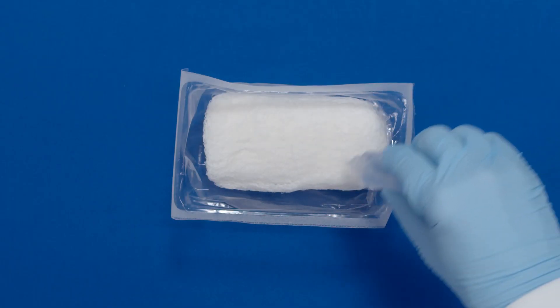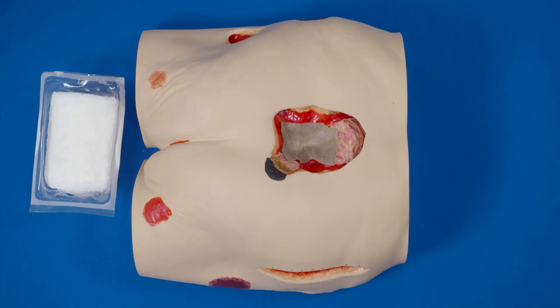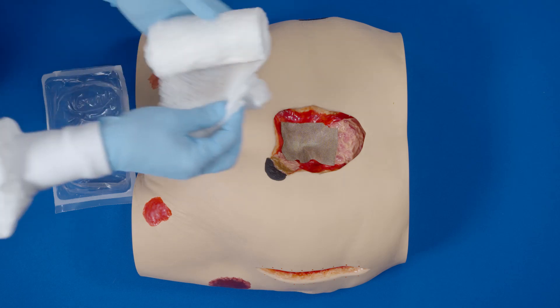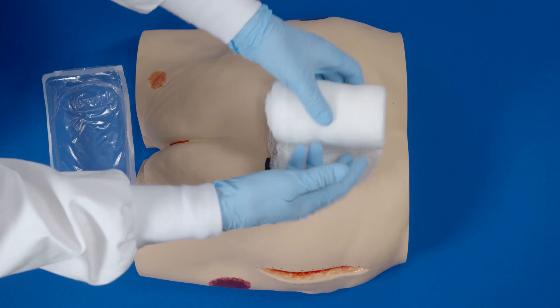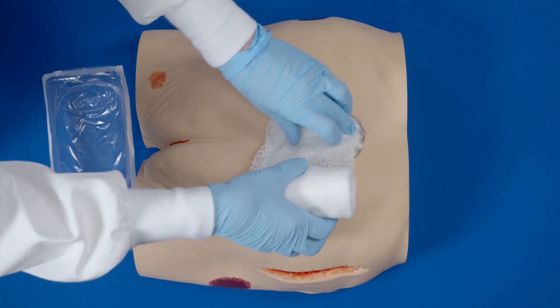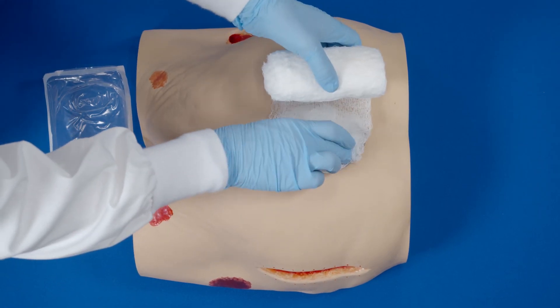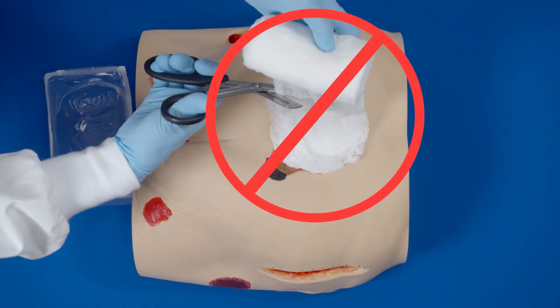If filling tunneling or undermining, ensure that gauze communicates with gauze in the base of the wound — gauze touches gauze. The gauze should fit loosely into the wound bed. Do not pack tightly or force gauze into areas of the wound. Cut the gauze to fit the size and shape of the wound.